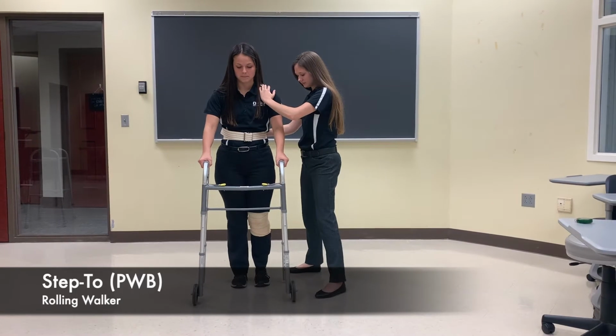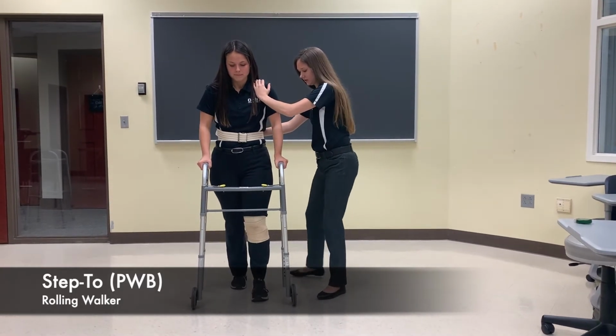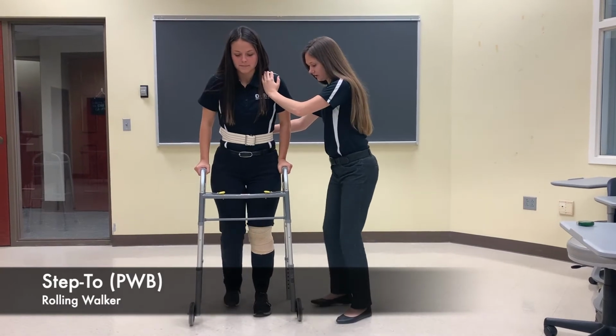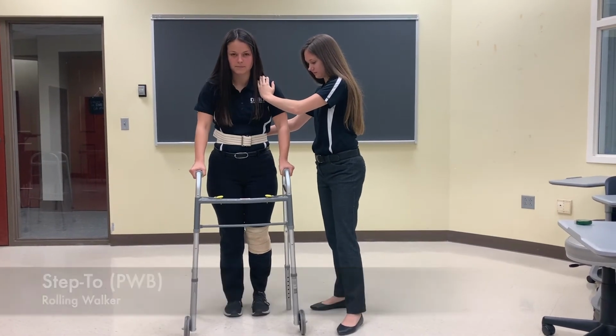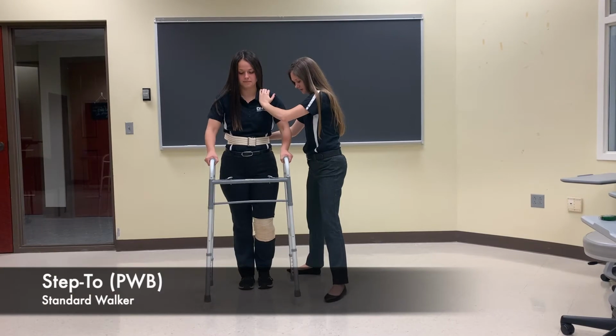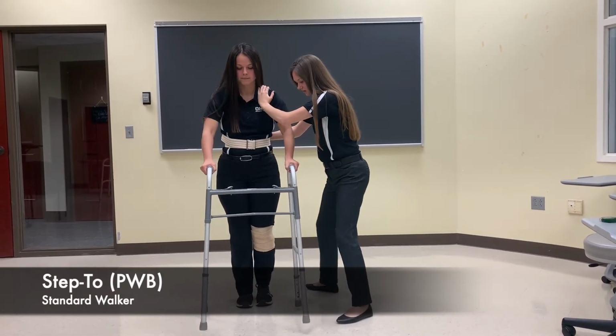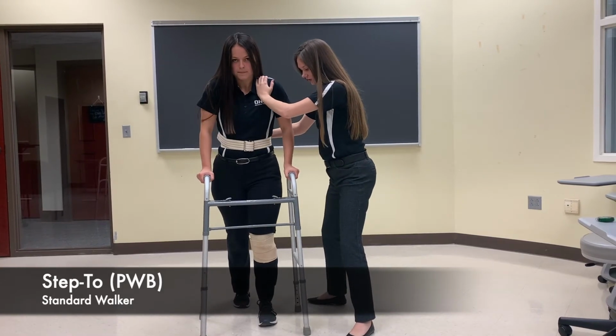Walker, bad leg, good leg, walker, bad leg, good leg, walker.